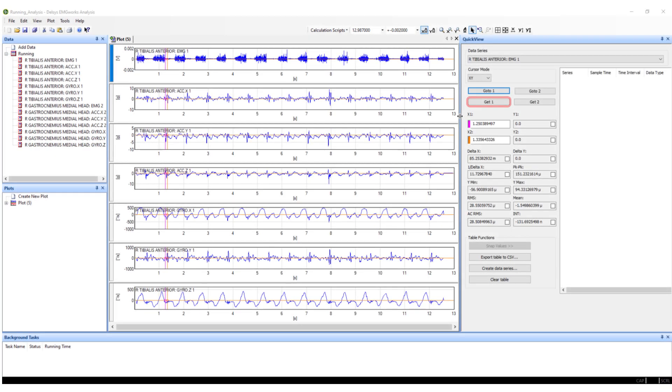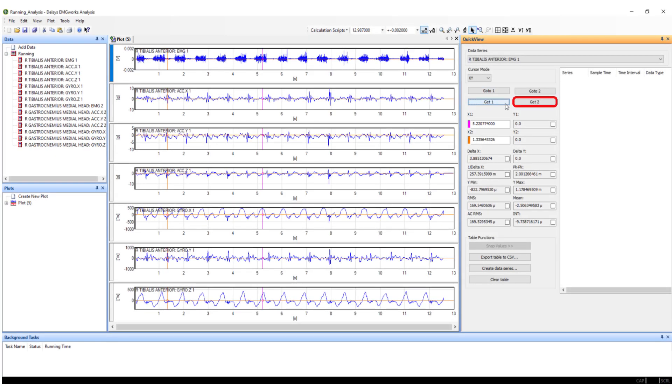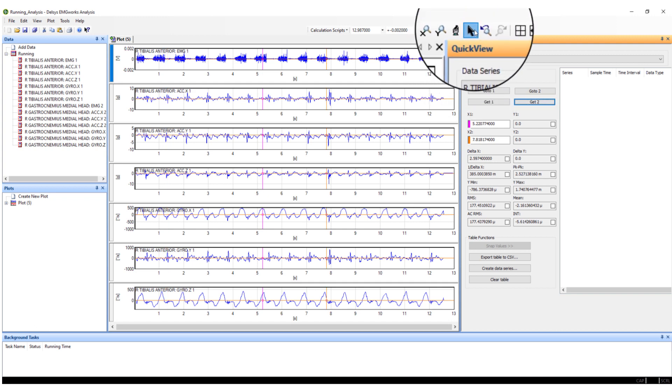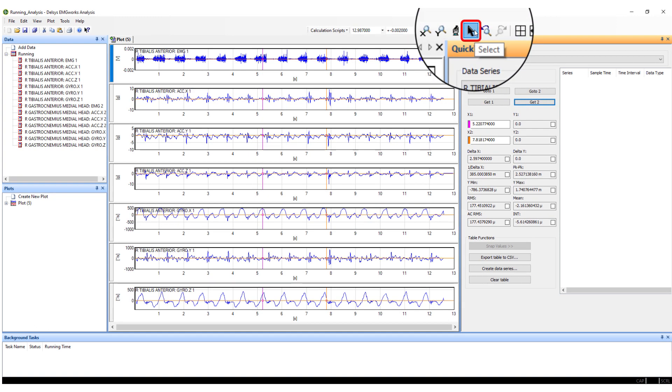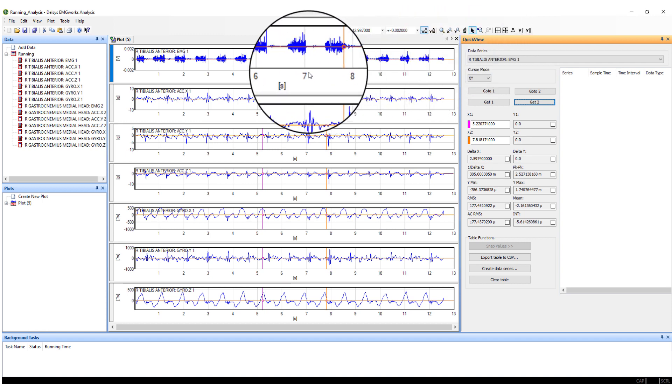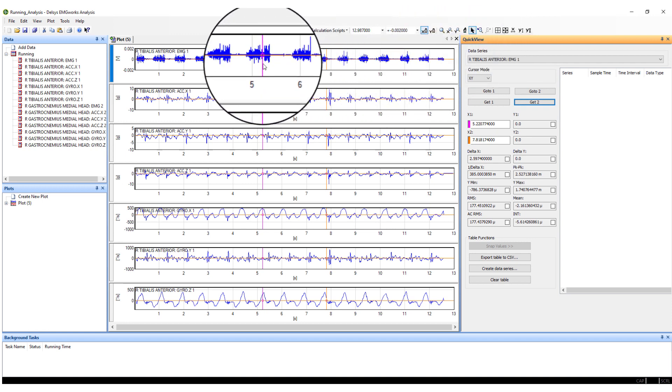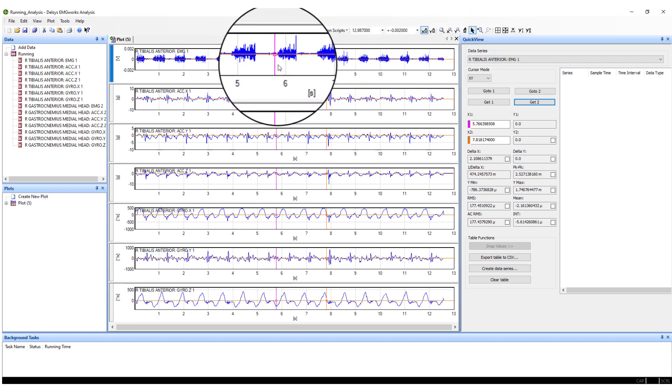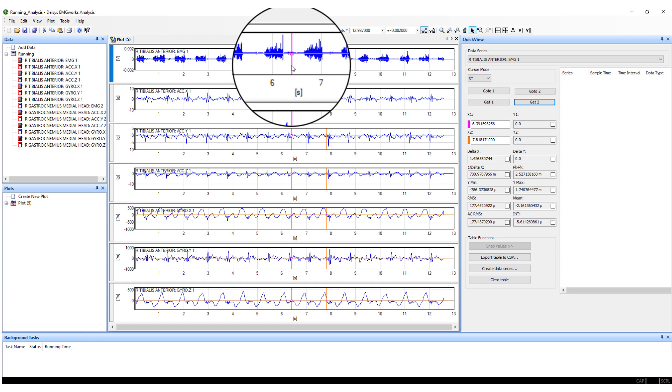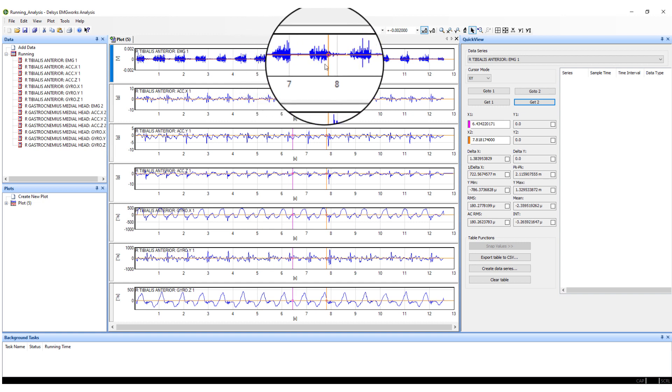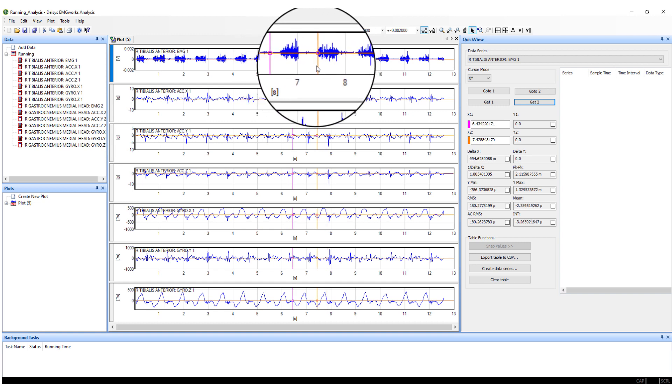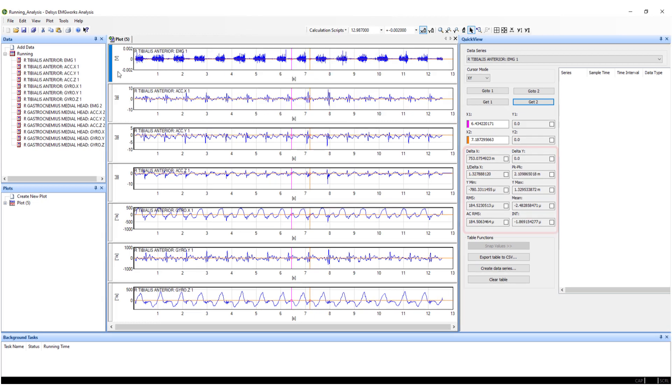By selecting Get 1 and Get 2, the X1 and X2 markers will be placed within the data channel. To adjust the markers, ensure the Select icon is highlighted within the toolbar and move the markers to cover the desired section of data. Time-windowed metrics such as maximum and minimum amplitudes, peak-to-peak values, and other values can be captured.